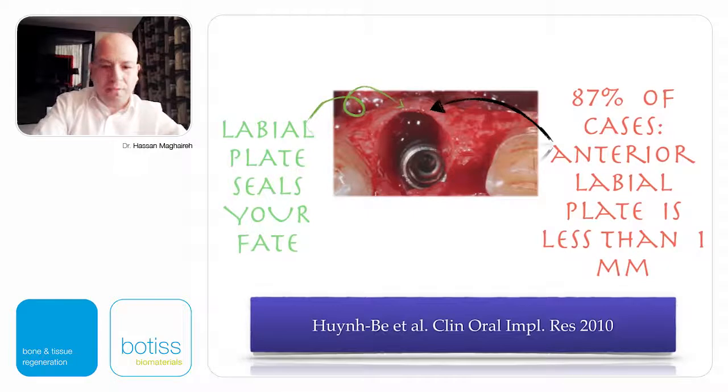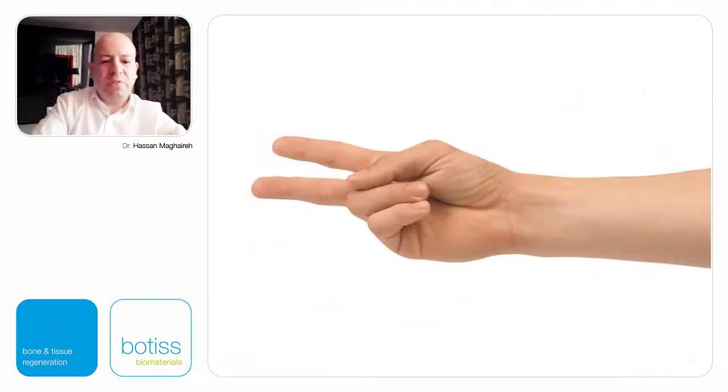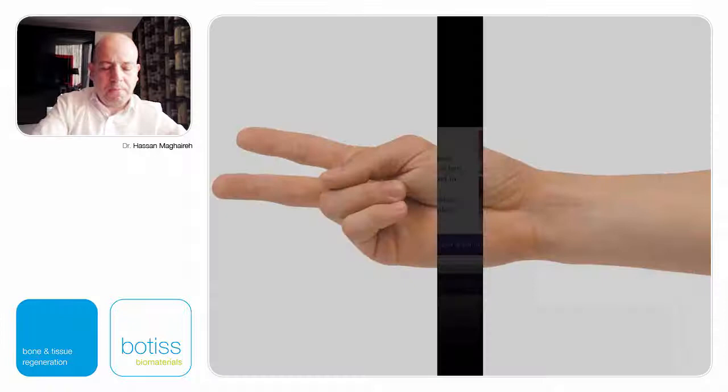Not to protect the implant. No, implant will have good primary stability from going in the original bone. The guided bone regeneration in this case was there to build the convexity, give me the good pink aesthetics, and in cases of early and immediate to compensate for any future labial bone removal.